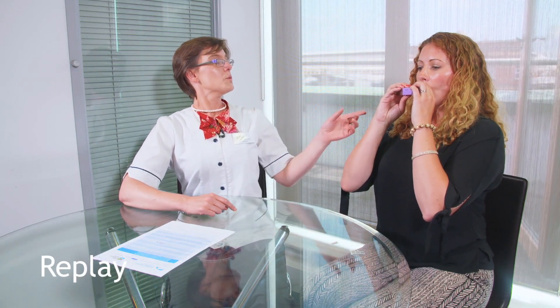Hold your mouthpiece at right angles to your mouth and place between your teeth. Close your lips around the mouthpiece. Breathe in rapidly and deeply through the inhaler, not through your nose.